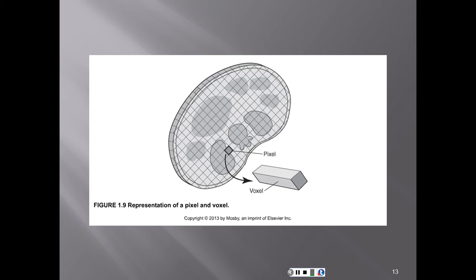So pretty much the computer is digital and needs information to be presented to it digitally in order for it to understand. So that's where pixels and voxels come into play, because the computer would rather have numbers, so it is divided up into a group of numbers, and then it is converted back to an analog format from a digital format, pretty much what we see here, so that we can appreciate it, because we love an analog format, whereas computers like the digital format.